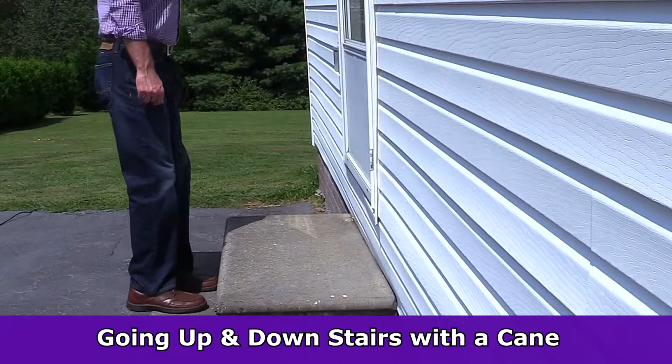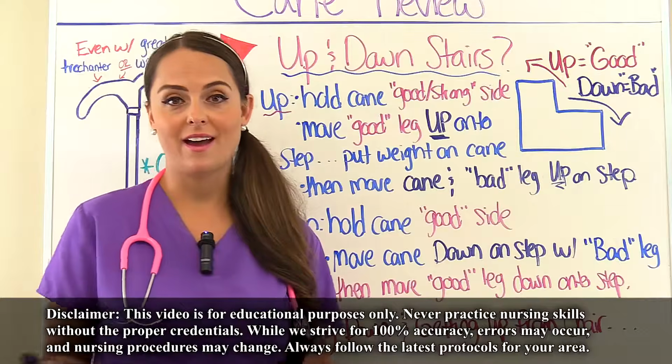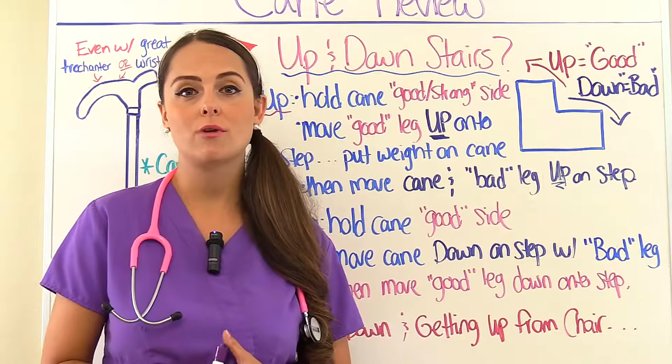In this video I'm going to demonstrate how to go up and down the stairs with a cane. So how does a patient go up and down the stairs with a cane? Well, the concept is the same as how we learned with crutches.